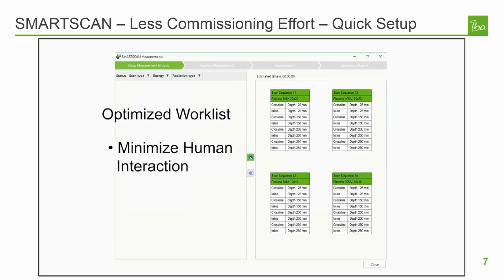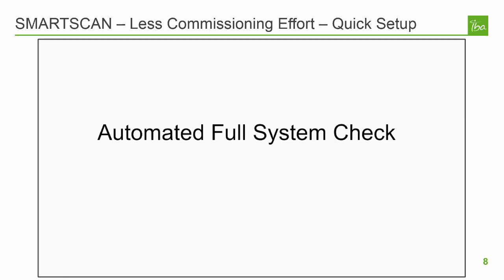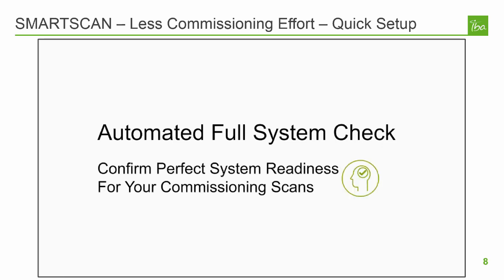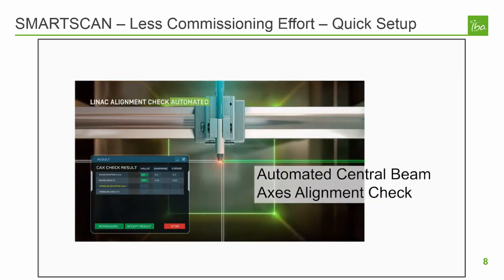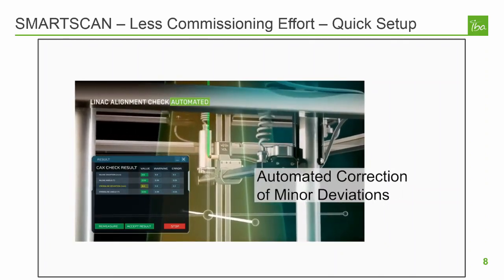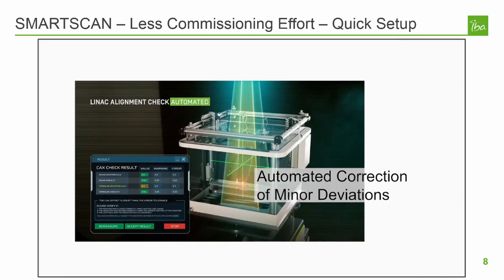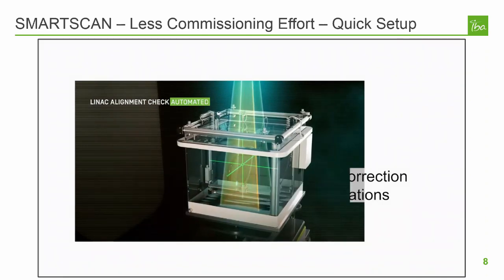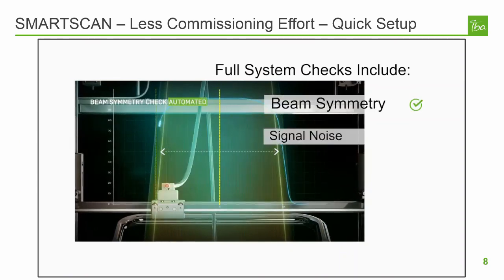Once the queue is optimized, SmartScan also provides an estimated time to complete all the measurements. Before starting your scan queue, SmartScan will perform a few baseline measurements. These measurements will establish the proper number of monitor units to be requested for the scans in your queue by checking the dose rate and performing background measurements. The central axis check will report either a passing or warning status based on the tolerances defined by the user. A central axis check can fail either due to shift or angle deviations. Angle deviations need to be corrected mechanically, but the user can choose to allow the software to correct ISO center for shift deviations.